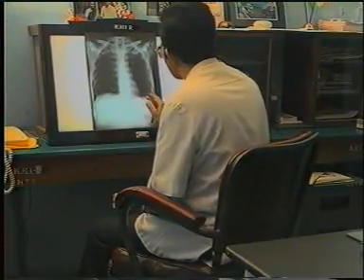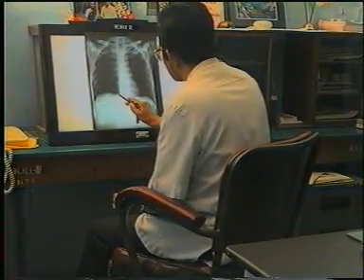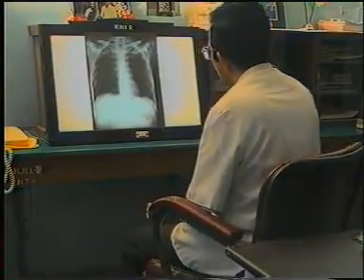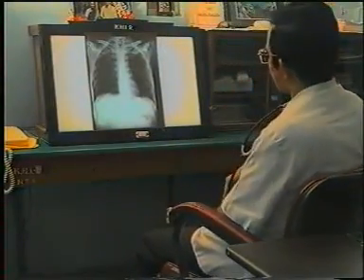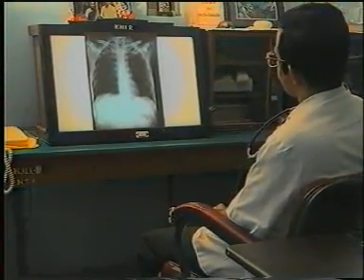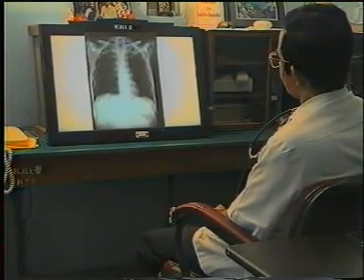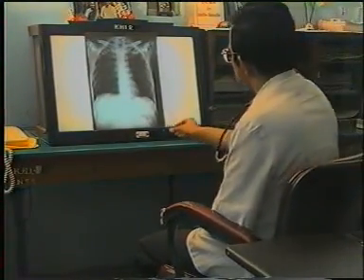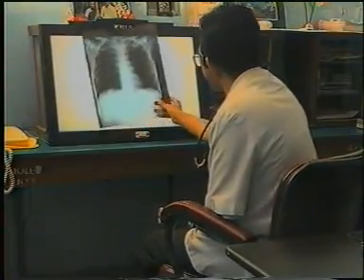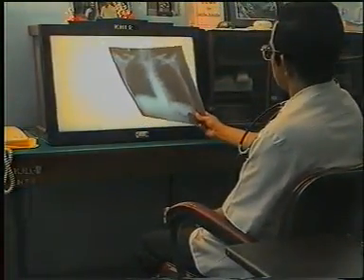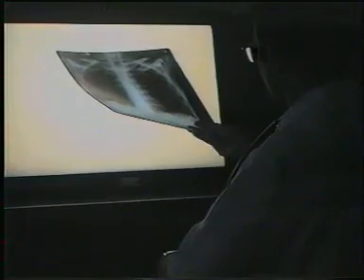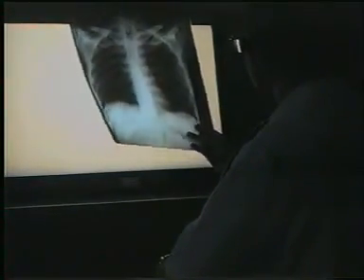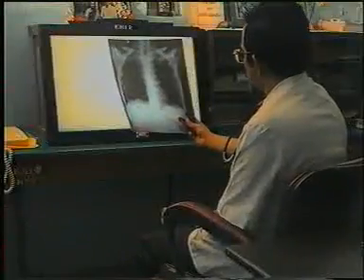After studying all these minute details, it is very important to stand at a distance and look at the film as a whole, because many times a close and minute inspection may miss a gross change. Then hold the film at an angle and view it slightly tangentially — minor changes in radiolucency of the lungs are better appreciated this way.